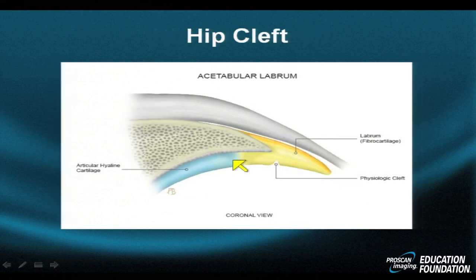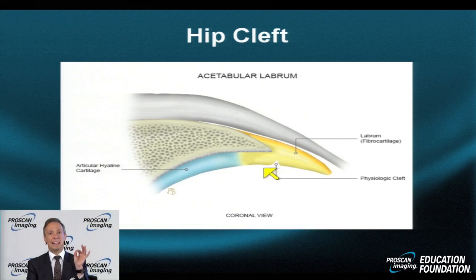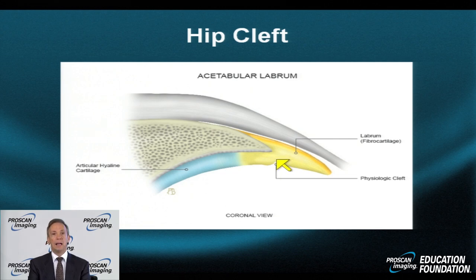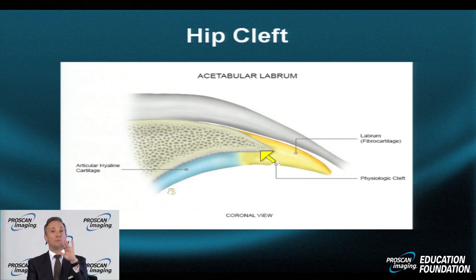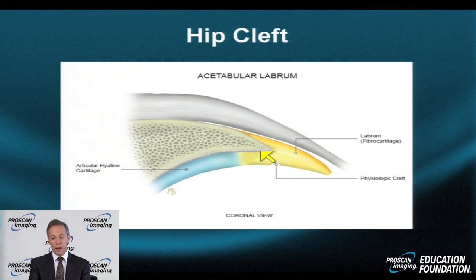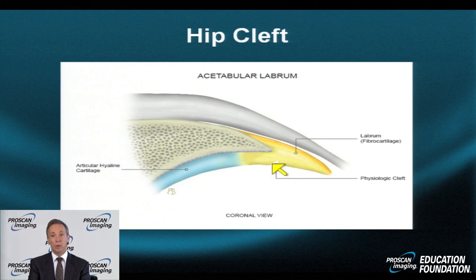Here's an example of a small physiologic cleft. The difference between a cleft and a sulcus is really all about the shape of the apex: a cleft has a more tapered tip, whereas a sulcus has a more rounded tip. The difference between a physiologic cleft and a true tear is that a true tear is usually more knife-blade-like — not so wide at the base — whereas a physiologic cleft is wide at the base and narrow at the apex. The sulcus is curvilinear at the apex.